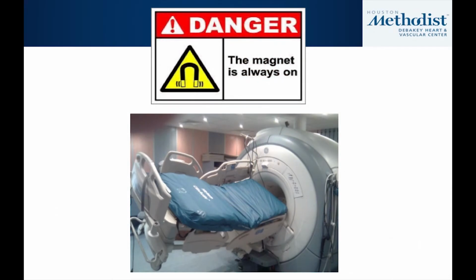Okay, so that was a great discussion. I'm going to flip the table a little bit here. I want to touch on safety, because almost once a month I get a call. Obviously, safety with MR is very important. About once a month I get a call asking, are these metallic valves safe? And so I want to address that issue.